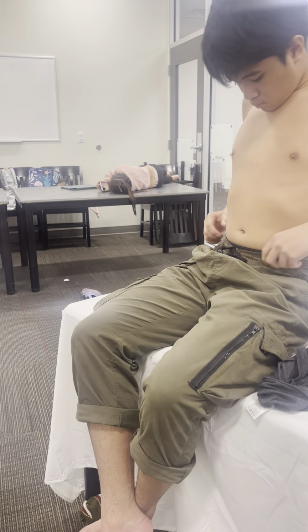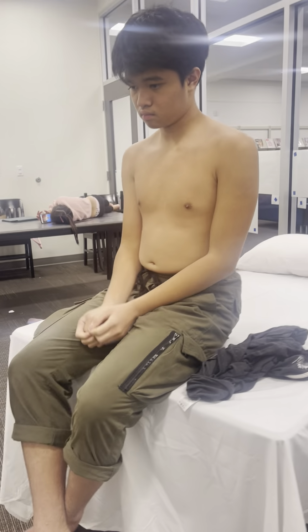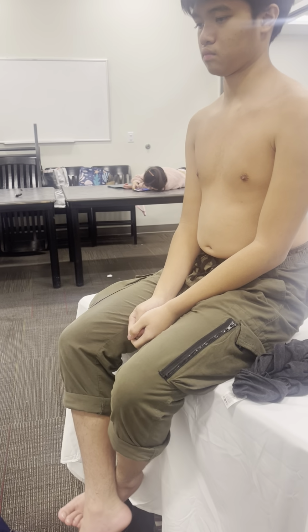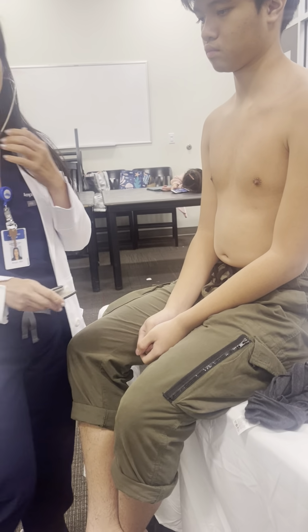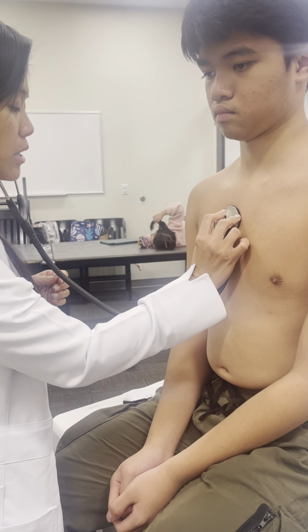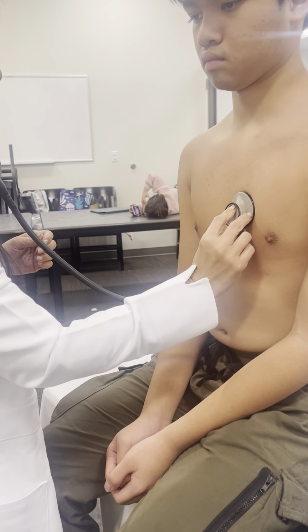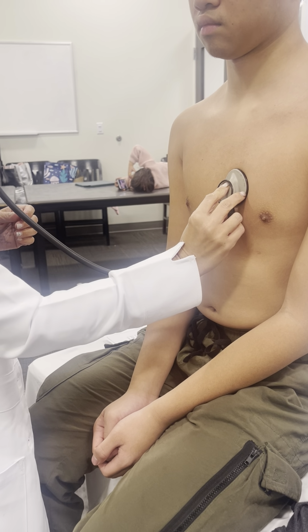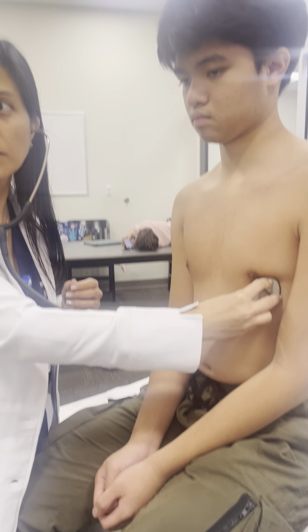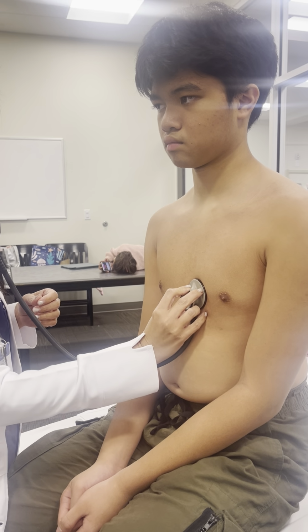So, and then now I'm going to auscultate your heart sounds. So first is the aortic, and then pulmonic, and this will be the Erb's point. And then the mitral. And then this one is the tricuspid. Okay?